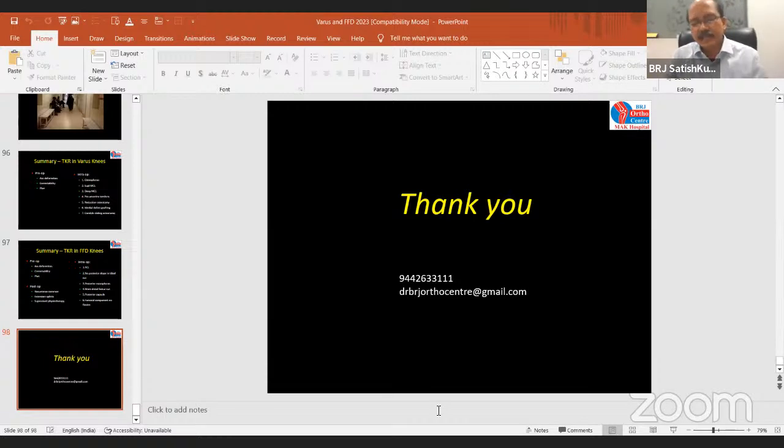So assessment, as I said, is initially clinical. You can see clinically the patient is walking with a significant varus thrust. Number two, obese patient. This is the clinical side. Then number two, X-ray: how much is the lateral subluxation? Where is the lateral femoral margin and where is the lateral tibial margin? If the lateral tibial margin is too far away, that means it is subluxed, that means there is lateral stretching. And sometimes there may not be subluxation, but there will be a lot of lateral opening. So this is what you can see on the X-ray.